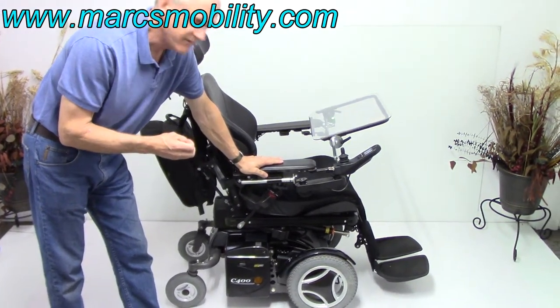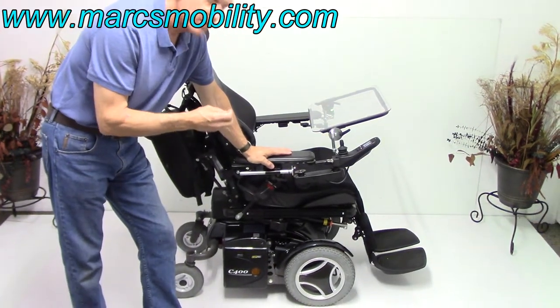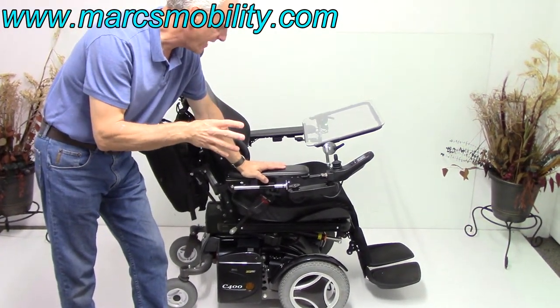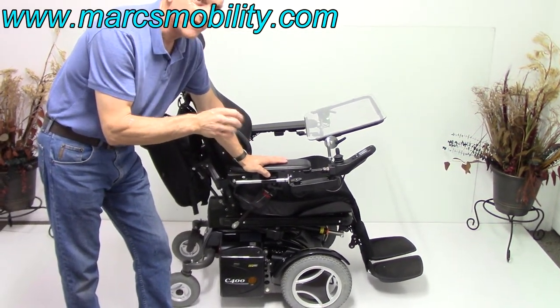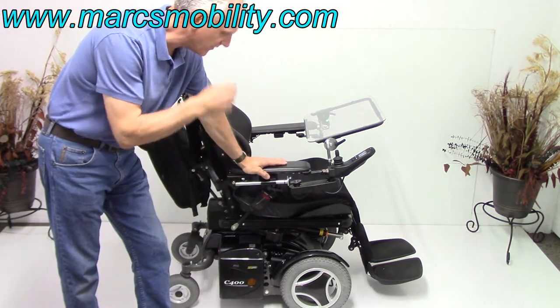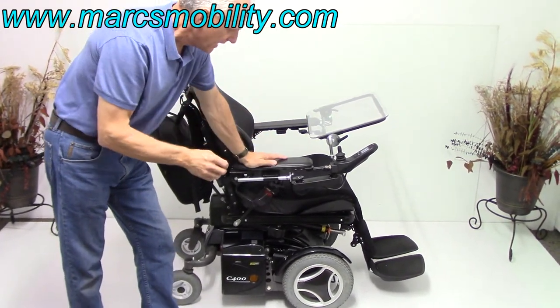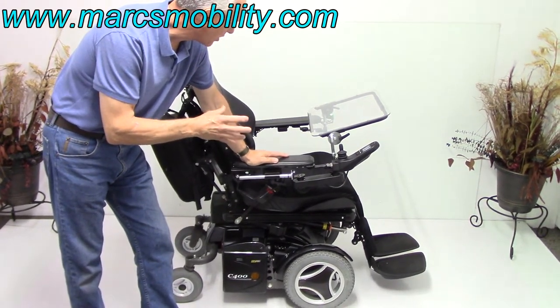This is a Permobil C400 ESP power chair. This Permobil C400 is a little bit smaller than the C500 and maybe a little bit bigger than the C300, so it's in between the two of them. If you want a power chair that's a little bit smaller and more maneuverable, it's still a fairly good sized chair, but just a little bit smaller.